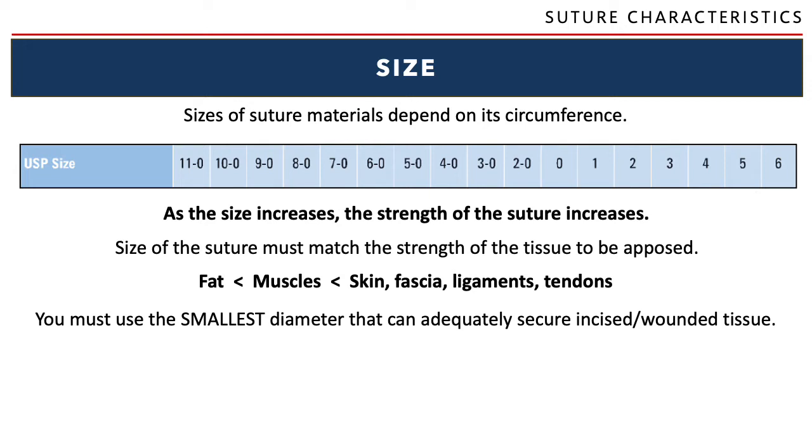But sometimes because of the difference in size of the animal, like for example, a big dog, okay, or a fat one, right, you would require a bigger amount of suture, even if it's the same tissue. Okay, if it's the skin of a cat or a small dog, usually 3/0 would do, but you might need to go to a 2/0 if it's a bigger dog, right? Even if it's the same skin.